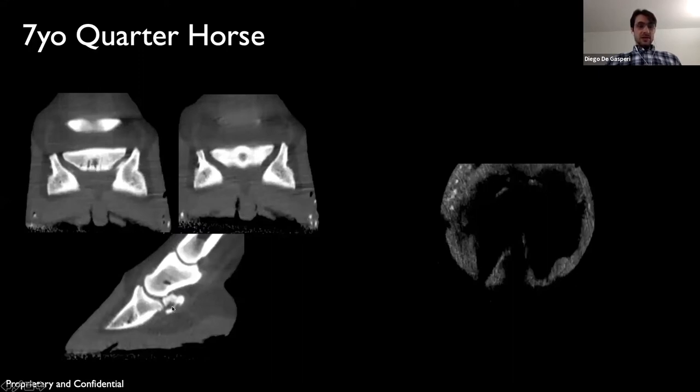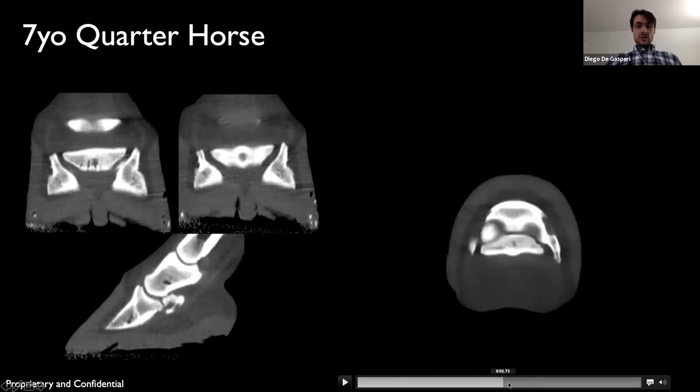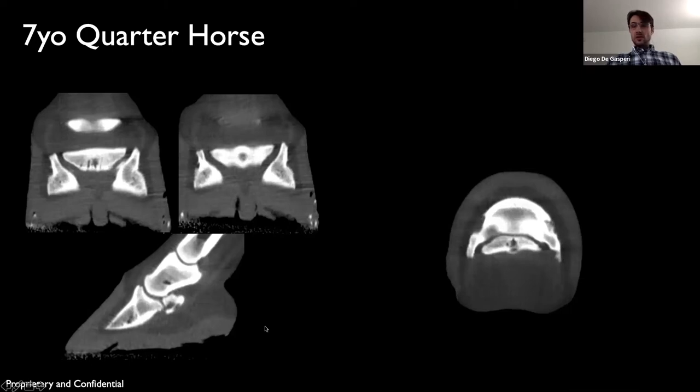And in this particular case, that very large lesion did not seem to communicate with the large erosion found on the flexor cortex. Again, we're gonna run the video and show these in a transverse view. We can also see right there, you can also see it's kind of a star-shaped lesion on the spongiosa of the bone, and there is a separation from that lesion to the large cortex erosion.